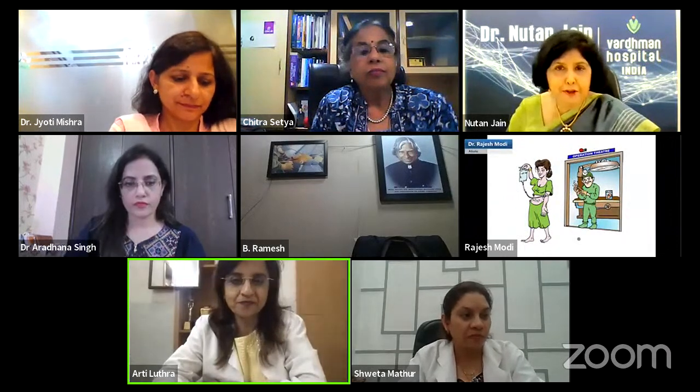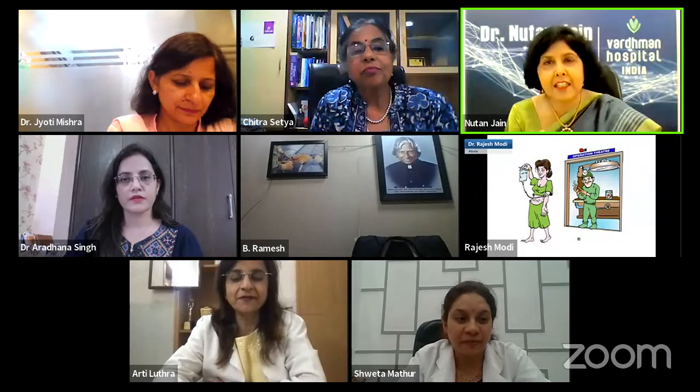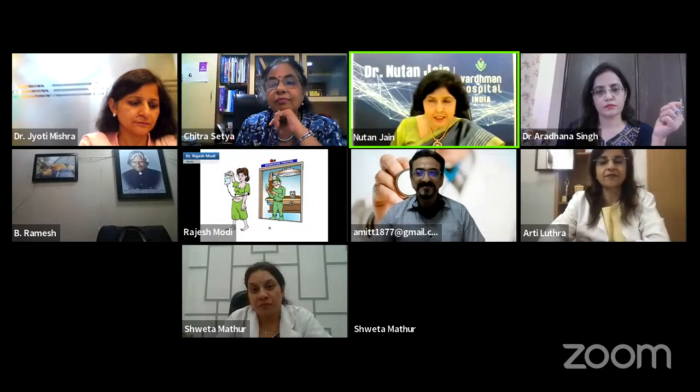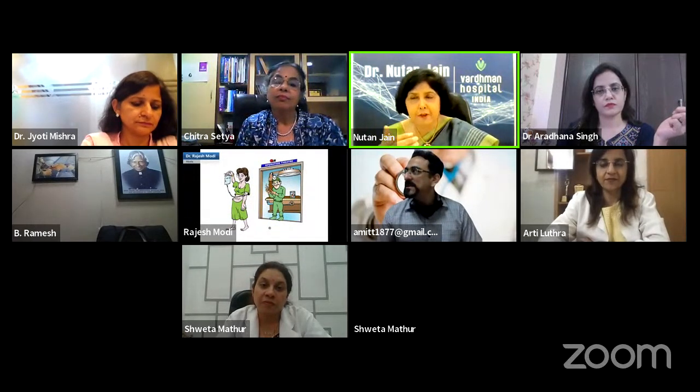Continue with some discussions by the time they join. Yeah. So, should I ask questions to you only? I'm just coordinating. Yeah, give your tips. I was just wondering when I saw Dr. Richa bringing out the cervix, it was inside the patient's abdomen. So, to avoid this type of situation, the cervix, which is in the vagina, has more anaerobic infection. So we can tie sutures on the cervix, and the vaginal end assistant keeps pulling on the sutures so that the uterus remains tangible. You have a hold on the uterus from outside, and we can morcellate the uterus only to the extent which we need to downsize the uterus and then bring it out.